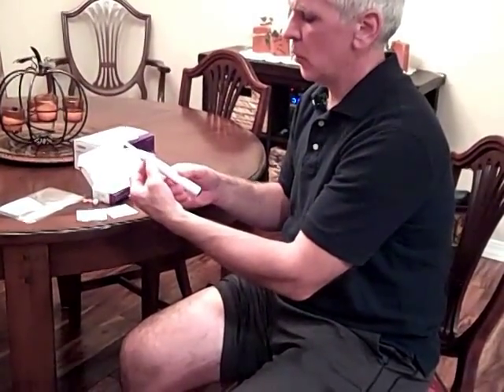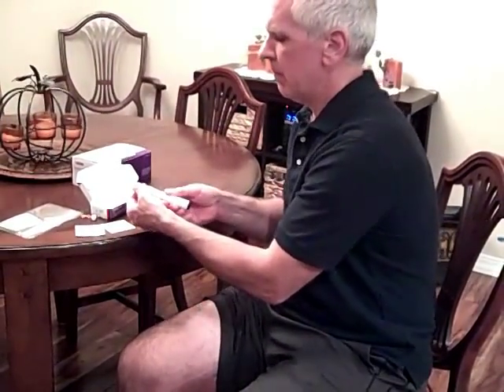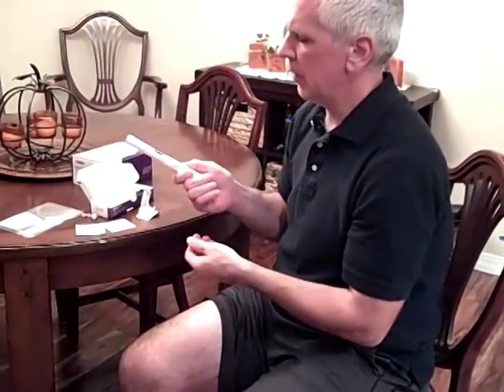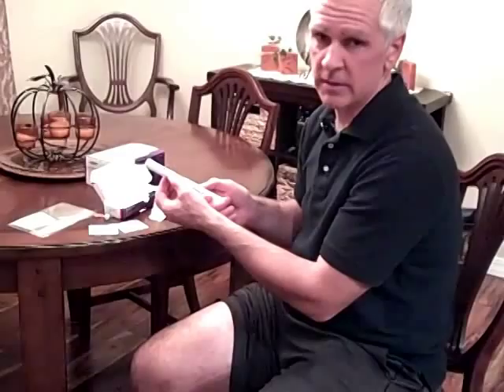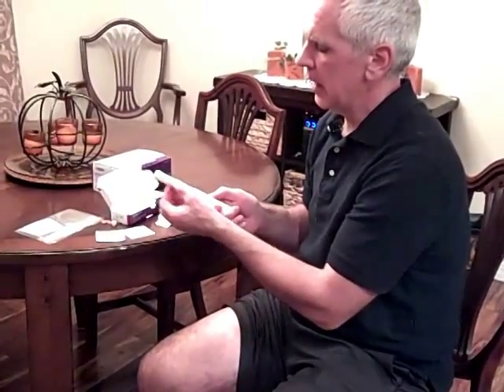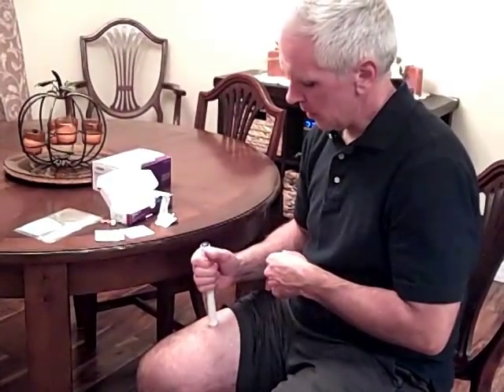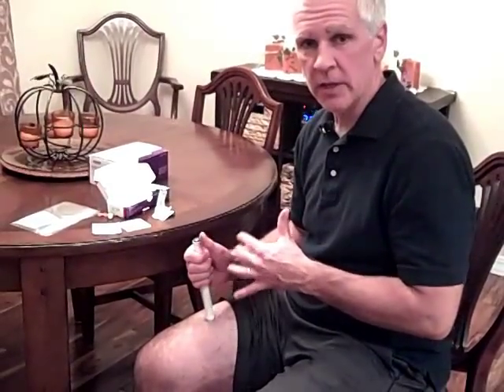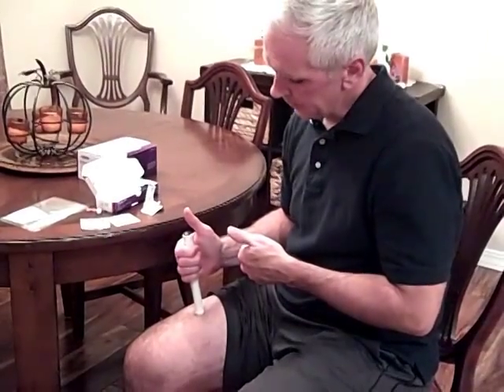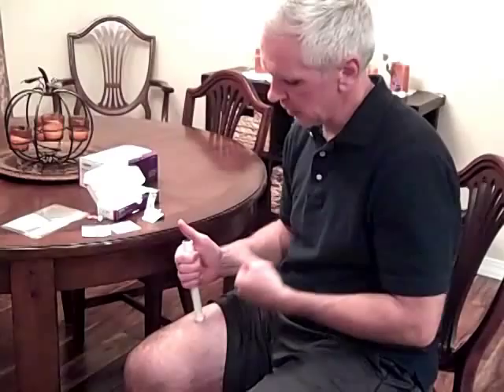The next thing you'll do is pull this sleeve out and that's going to pop off the safety shield. The needle is behind this shield. Then we're going to go ahead and put it on our leg. You have to make sure and put a little bit of pressure, because otherwise the button won't work — there's a safety in there that won't release. Once it's on the leg, just go ahead and push the button, and you heard it actually go in.